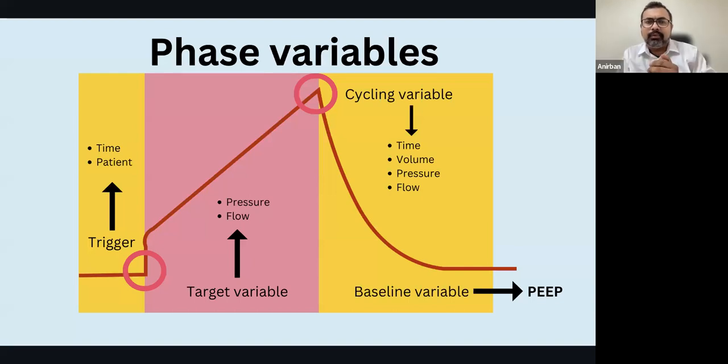Now he has developed bronchospasm, you are not around, and now his airway pressure has reached 35. The moment it touches 35, no matter whether the entire volume of breath has been given or not, the ventilator will cycle into expiration. So this is seen only if the airway pressures have met the pressure alarm settings.